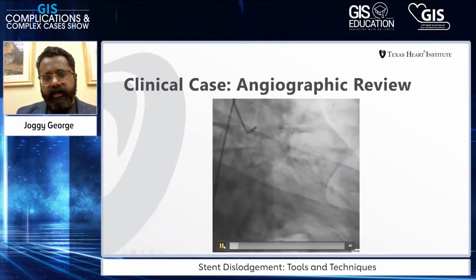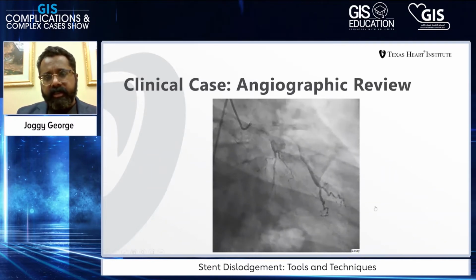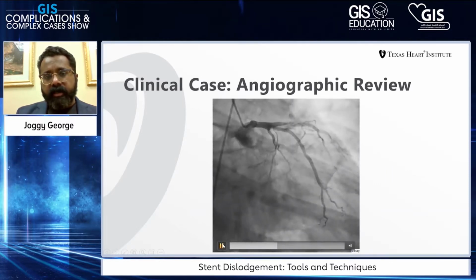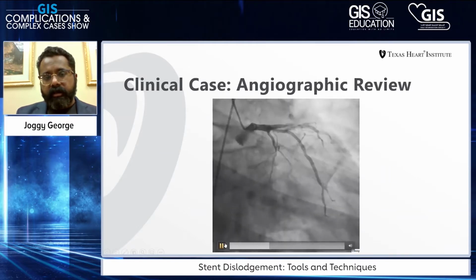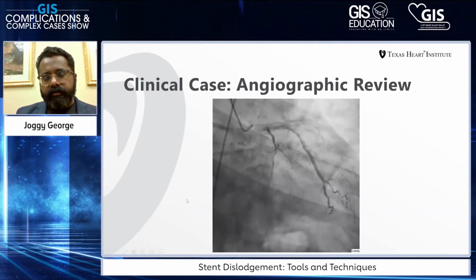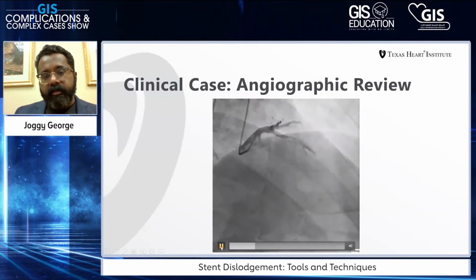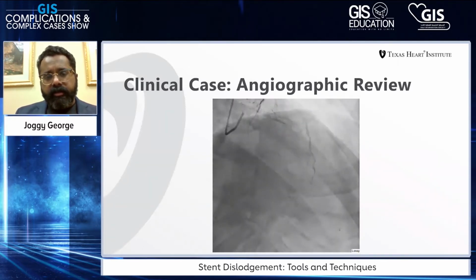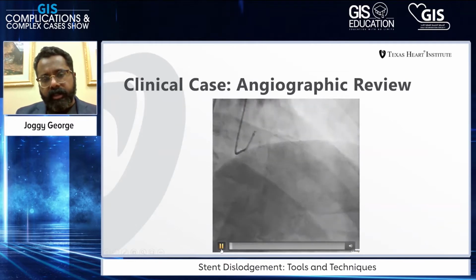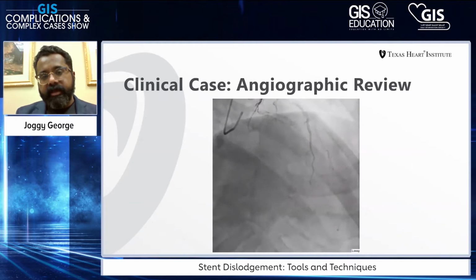This is part of the diagnostic angiograms. And as you can see, this demonstrates that he does indeed have pretty severe in-stent restenosis of the proximal LAD stent. We're looking at different images of the same segment of the artery here. Once again, we have a subtotal stenosis of the proximal LAD stent here.